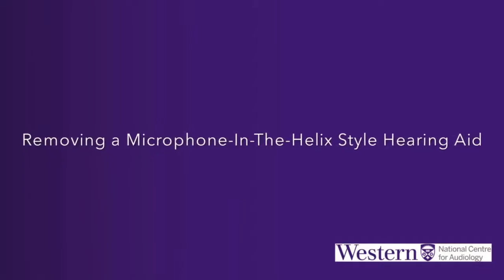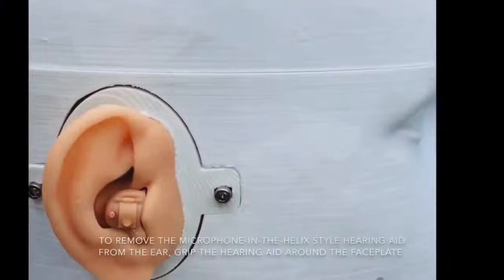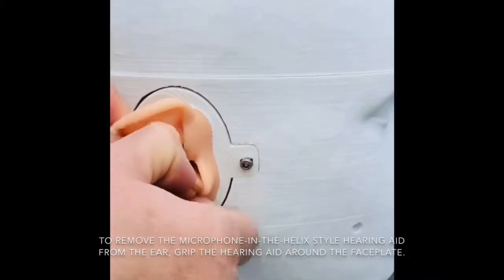Removing a microphone in the Helix-style hearing aid. To remove the microphone in the Helix-style hearing aid from the ear, grip the hearing aid around the faceplate.